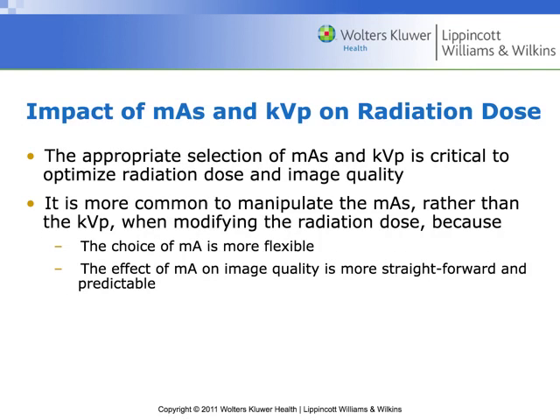So these things have a direct tie to the radiation dose, and what we're really trying to shoot for is a way to optimize the image, right? I can crank down the mAs and get crappy pictures all day long, right? So the name of the game isn't necessarily to keep patient dose to an absolute minimum.